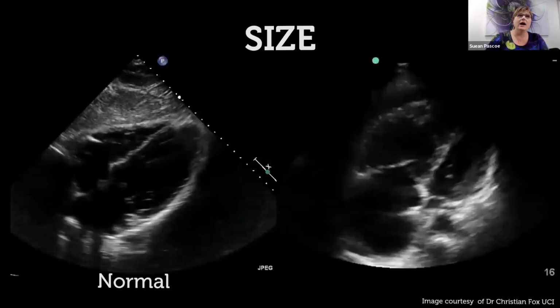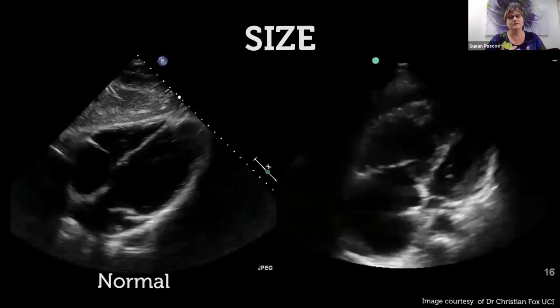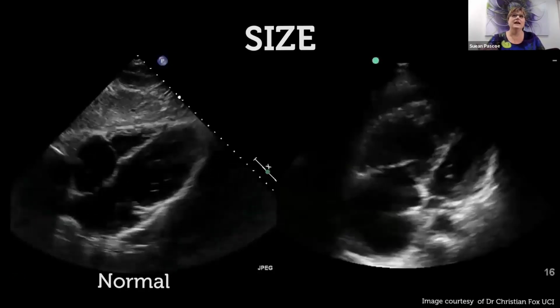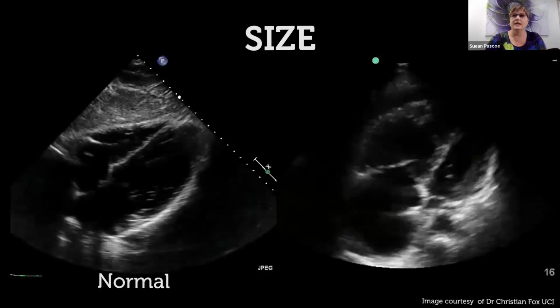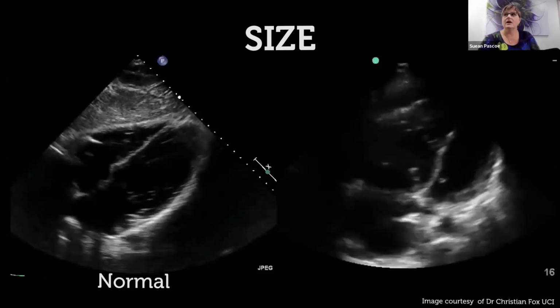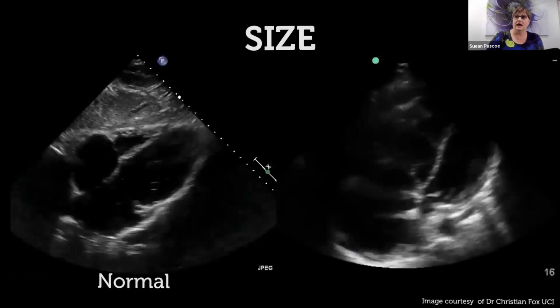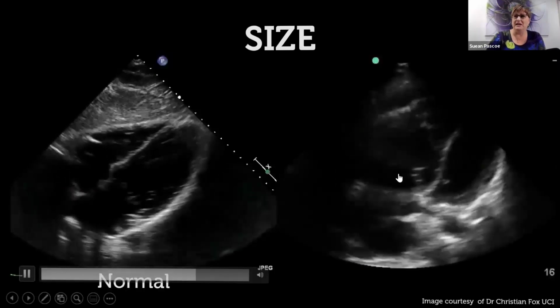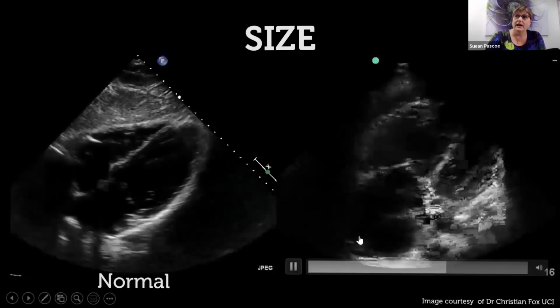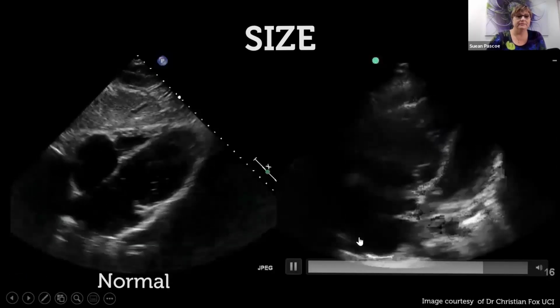So let's start by looking at the size. Again, the size of the right and left ventricles can be compared. The size of the atria and the ventricles can be compared. And when we start to notice the differences in size here, you can see that this heart has something quite badly wrong. Very enlarged right ventricle, very enlarged right atrium.